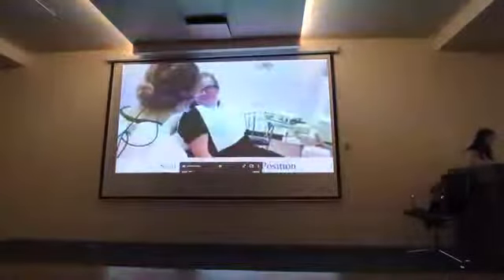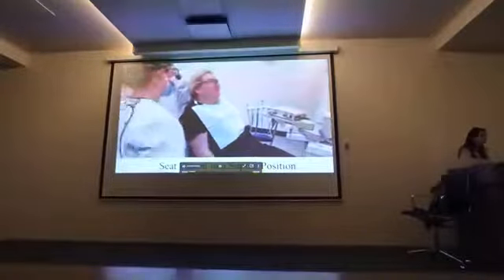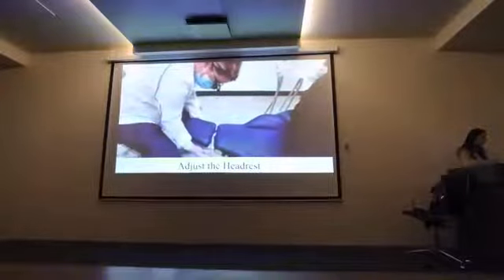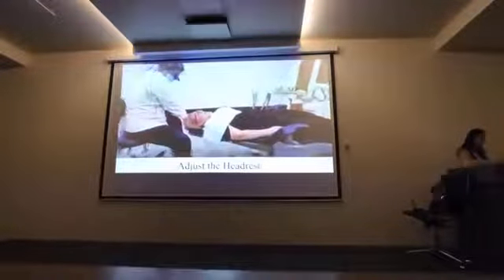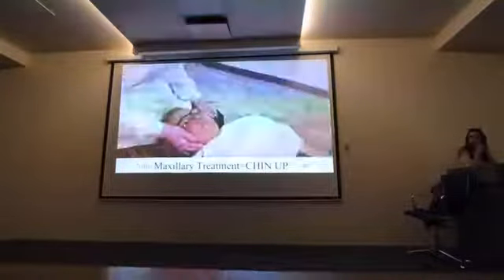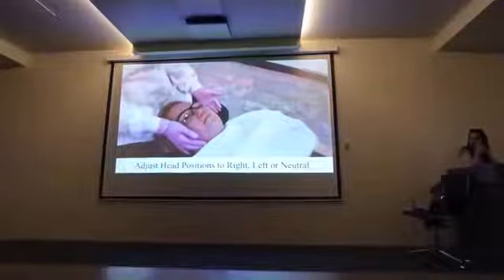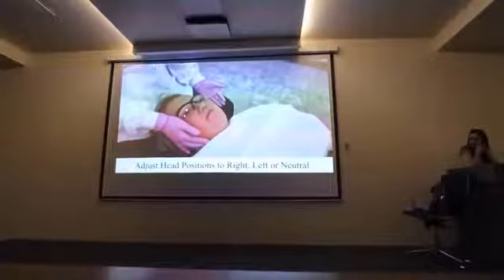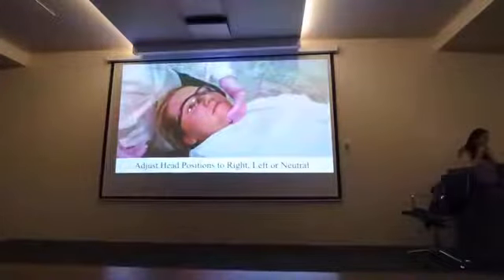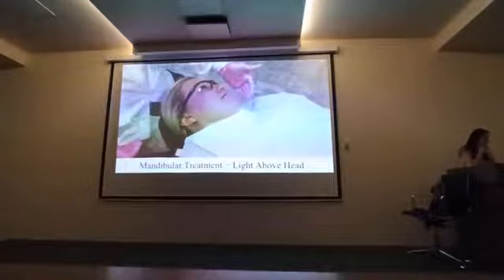Be sure to inform the patient that you're setting their back. Depending on the height of your patient, adjust the headrest. Then ask them to slide their head to the top of the headrest. When treating the mandibular arch, the chin should be down, and for the maxillary arch, the chin should be up. For right-handed clinicians, when treatment is done on the patient's right side, the head will be straightforward and neutral. For treatment on the left side, have your patient turn slightly to the left or away from you.